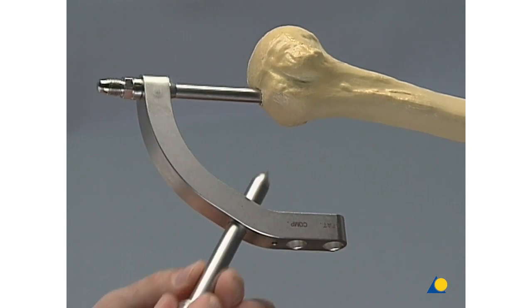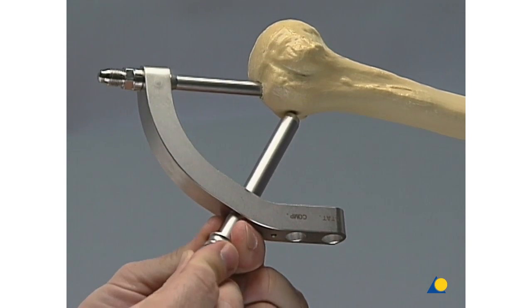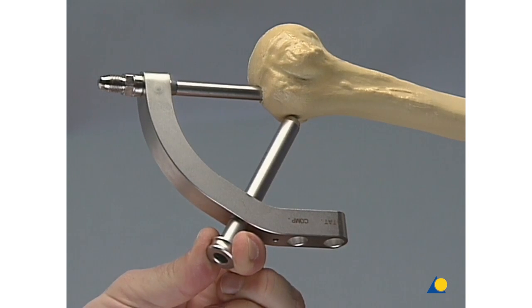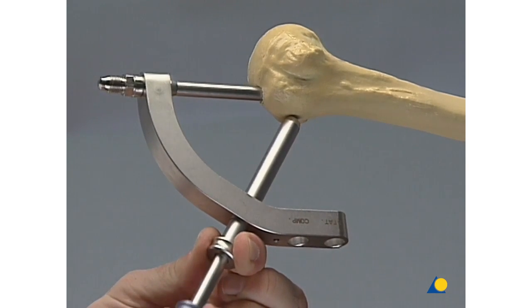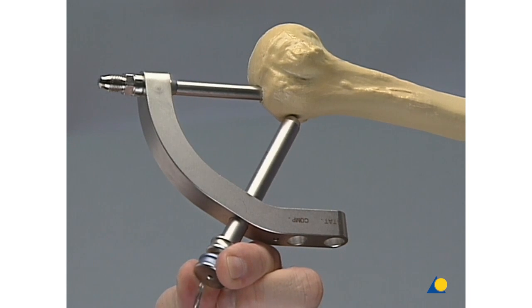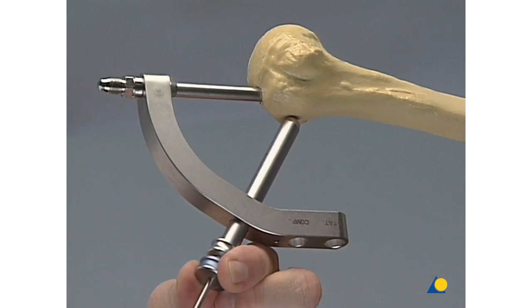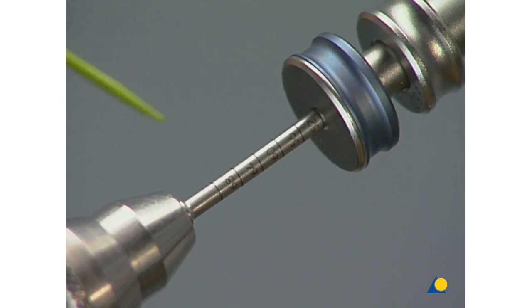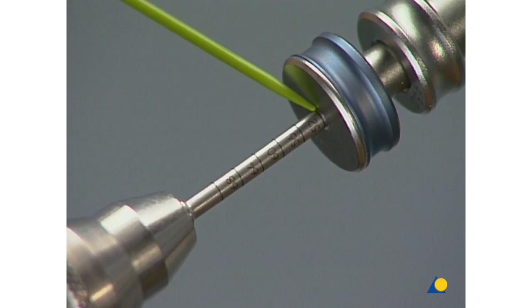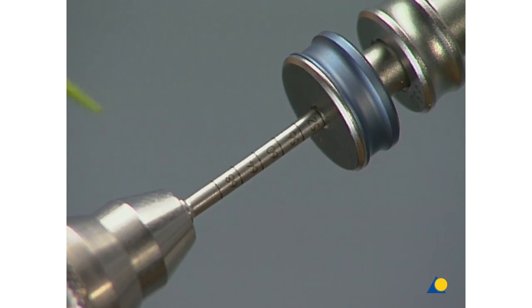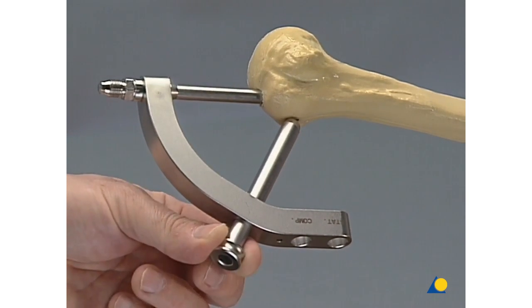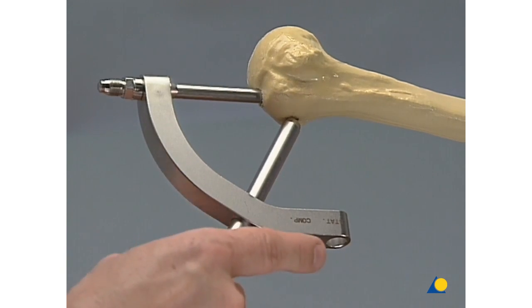We demonstrate the oblique locking technique. First, we insert the soft tissue protection sleeve with the trocar, and then replace the trocar by the 3.2 mm drill sleeve. The 3.2 mm calibrated drill bit allows direct reading of the required locking bolt length. Remove the drill sleeve and insert a 3.9 mm locking bolt through the protection sleeve.